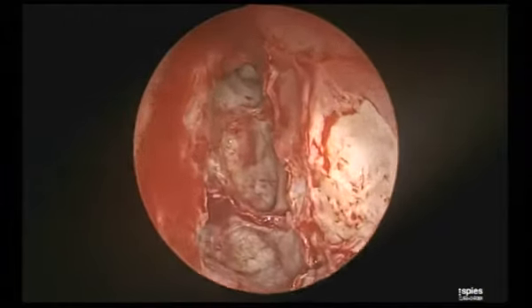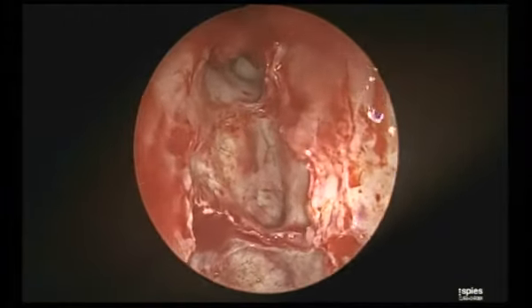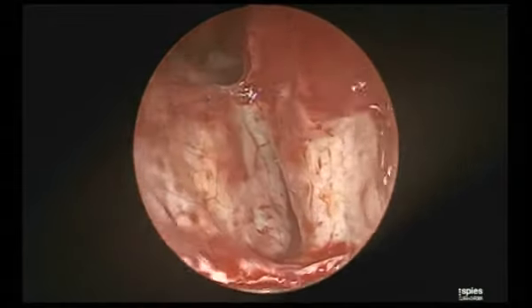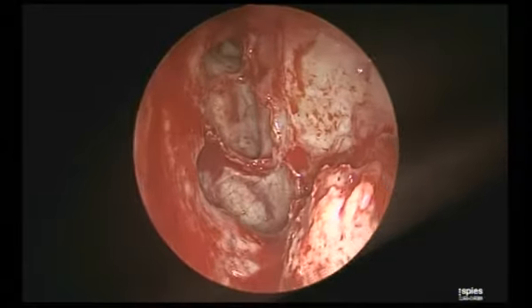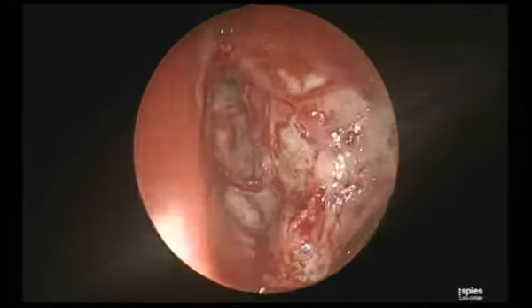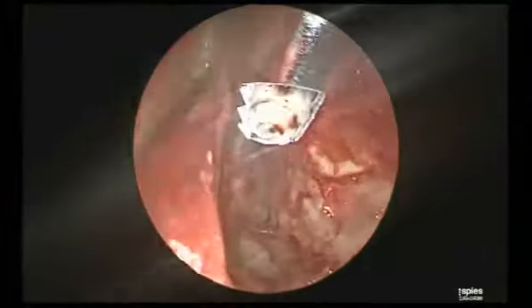Now see, again, the frontal sinus, see this supraorbital ethmoid cell, the fovea and the supraorbital recess, the artery behind, and that is the upper attachment of the bulla. Now what I am going to do, very thin ledge remaining, that I am going to remove with this reverse blade.